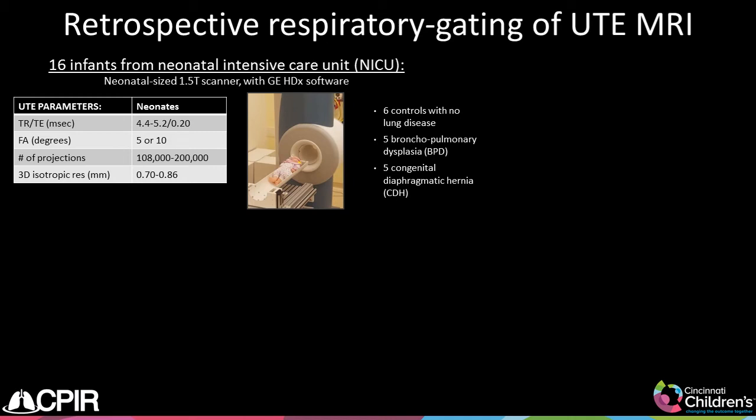After adult technique validation, we performed similar imaging and analysis on a NICU infant cohort with control, BPD, and CDH babies. This imaging was performed on a neonatal-sized 1.5 Tesla scanner, which is sited within the NICU of Cincinnati Children's Hospital, and it operates with GE HDX software.